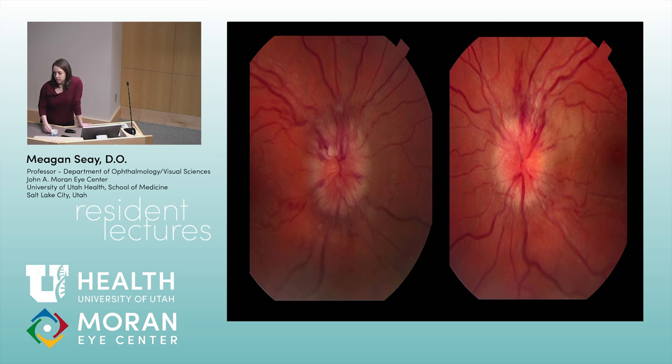Most common visual defects in papilledema: it can have no visual field change. Blind spots are one of the first things we see. Nasal depression is a very common one, and then it starts to get constricted. So these people often won't notice that they're losing vision because their acuity is 20/20 until their fields get so constricted. Just relying on the subjective nature of the patient's vision is not great. You have to actually check the visual fields formally if possible.